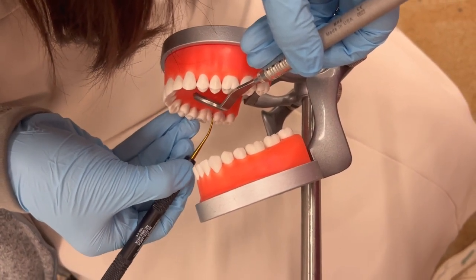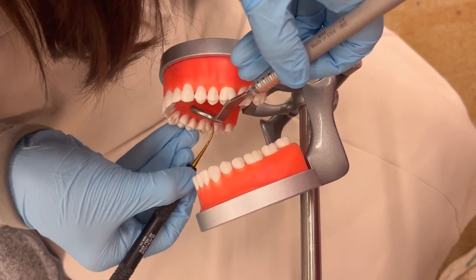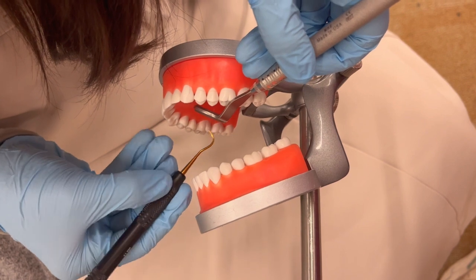So make strokes across the facial surface, roll the instrument handle to maintain adaptation at the line angle, and tilt the lower shank towards the mesial surface. Then you want to continue the strokes at least halfway across the mesial surface.